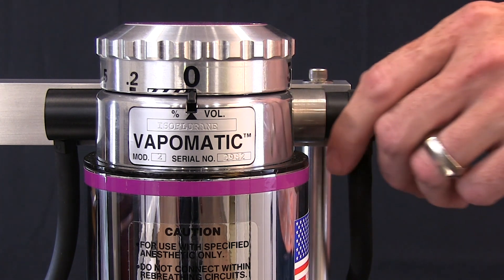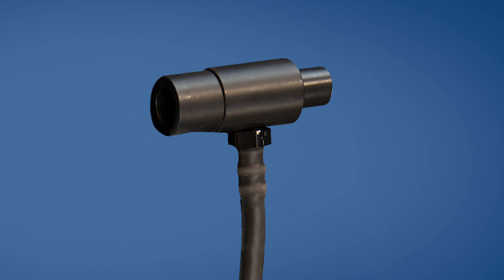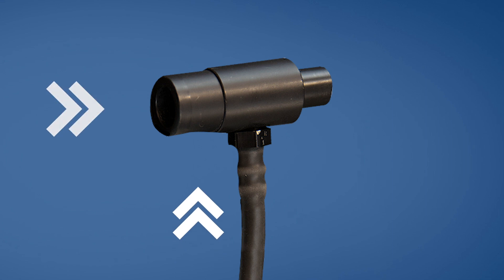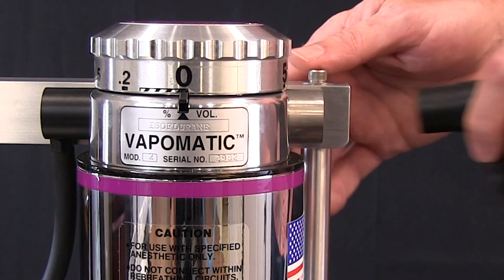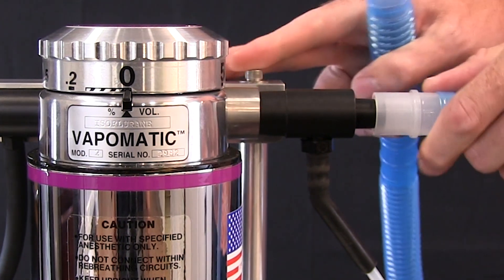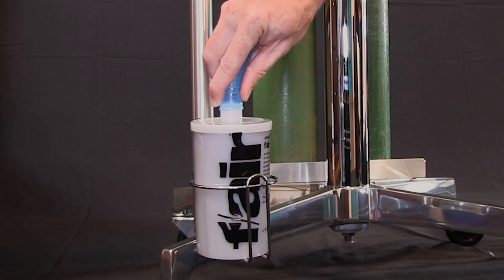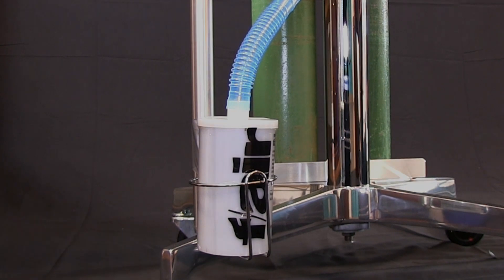Remove the male fitting from the outlet side of the Vapomatic vaporizer and replace it with the 23mm end of the Reichen sample T. The sample T is specifically designed to mix the carrier gas and the anesthetic gas. Securely place the sample T into the outlet connection to ensure anesthetic gas will not escape, and position it so the rubber connection is not bent or kinked. If you are unable to connect the FI-8000P to the outlet of the vaporizer, it is recommended to use the common gas outlet of the anesthesia machine. Attach one end of the blue scavenging tube to the 15mm side of the sample T and the other end to the F-Air canister. Note that the bottom of the F-Air canister cannot be blocked — it must be suspended or laid on its side to release the unabsorbed carrier gas.